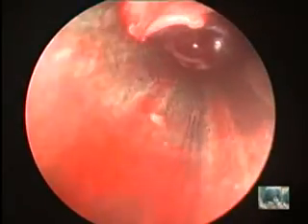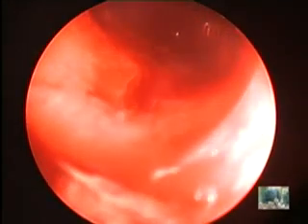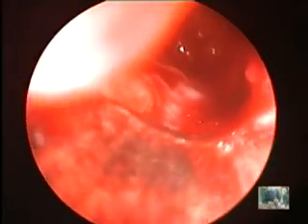Shane, we've got to look for that calcification that we saw on the CT scan. Make sure that it's not there. You've got to make sure you can visualize using the 70-degree scope through the trocar all the area of the maxillary sinus, so that you conclusively have evaluated the entire maxillary sinus. Right.